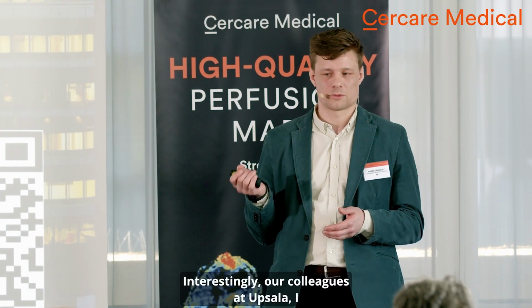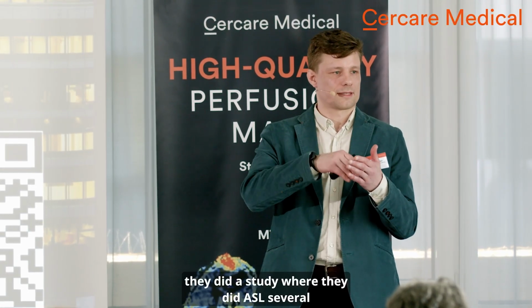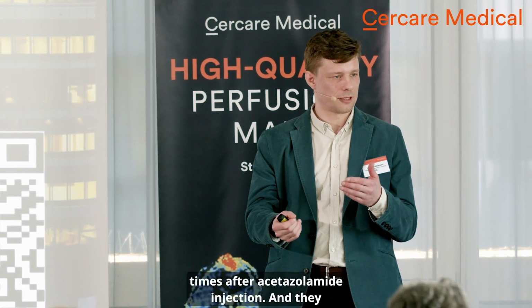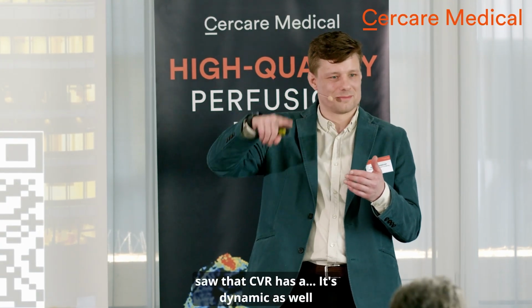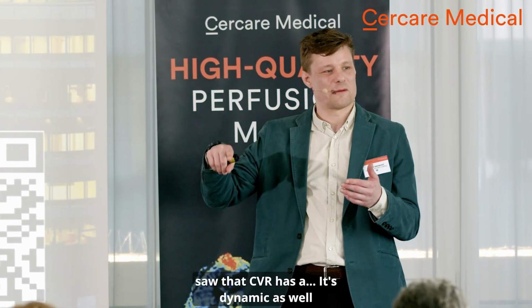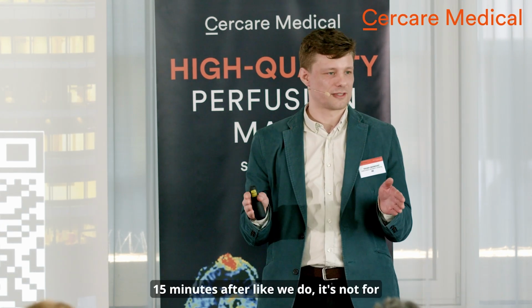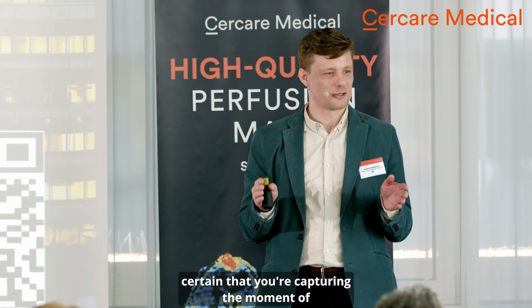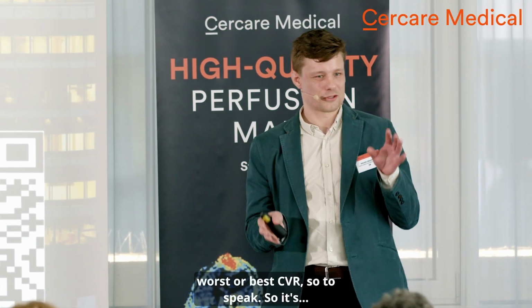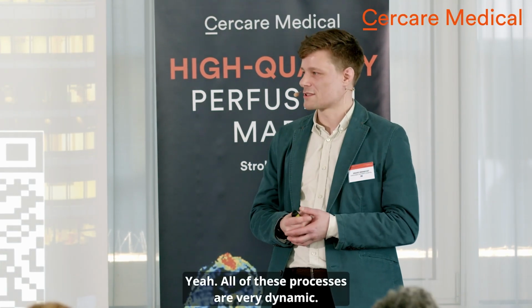Interestingly, our colleagues at Uppsala, I think they maybe presented that last year at the Perfusion Summit, did a study where they did ASL several times after acetazolamide injection, and they saw that CVR has a dynamic in the time after. So if you only measure 15 minutes after, like we do, it's not certain that you're capturing the moment of worst or best CVR, so to speak. All of these processes are very dynamic.